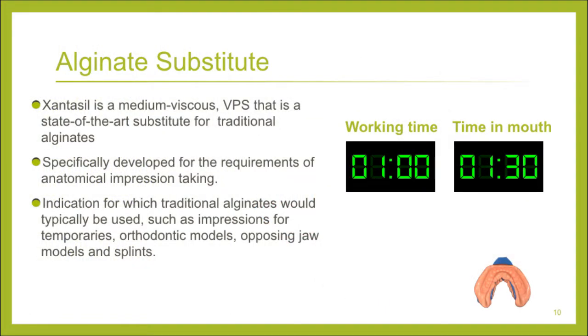Now, I am not a fan of alginate, I will tell you. I will take alginate when the teeth are flapping in the wind, and I know I might do an extraction that is no charge to the patient, but I'm not a fan of alginate. The reason is that after 20 minutes, it gets distorted. If I'm going to take an alginate, I want one that I have time to pour and that's not going to be distorted, but I can tell you that there are very few of those out there.